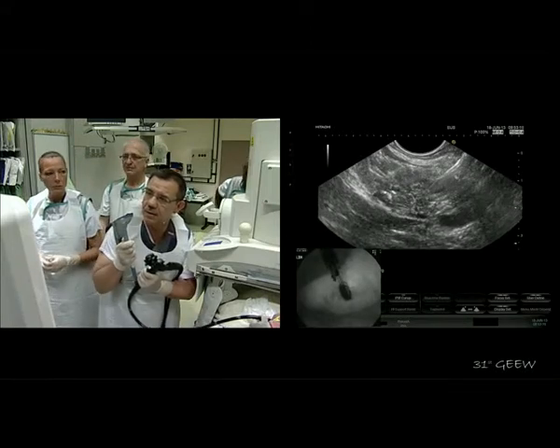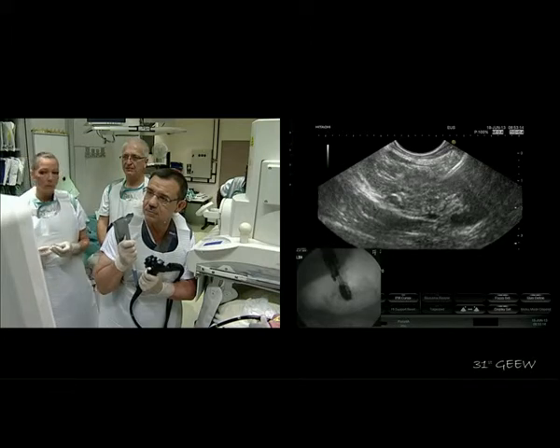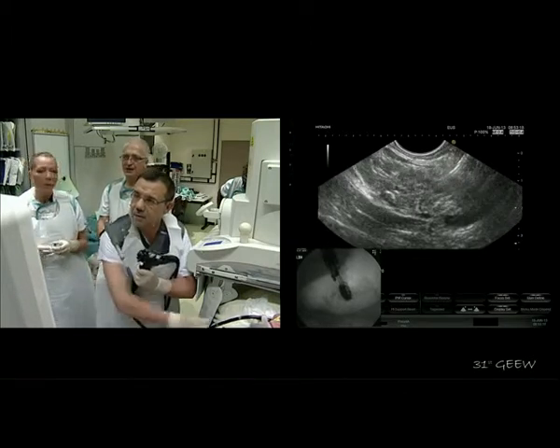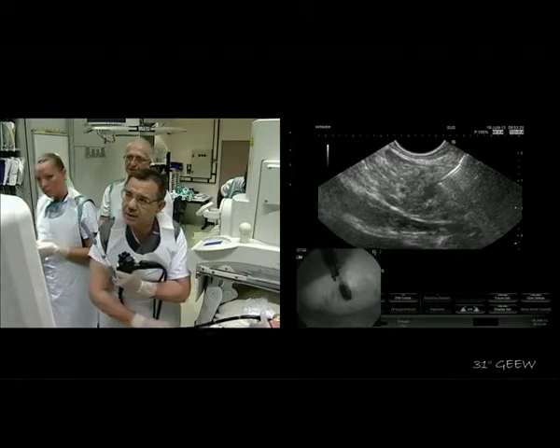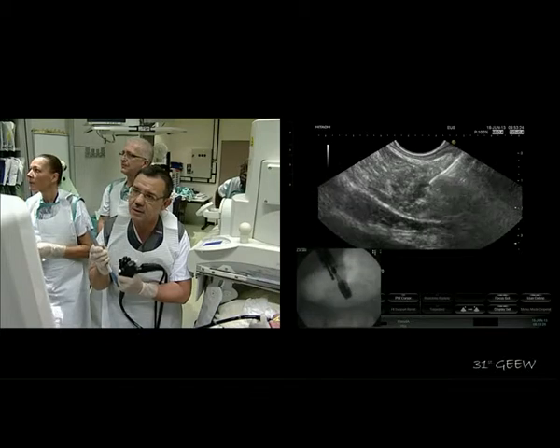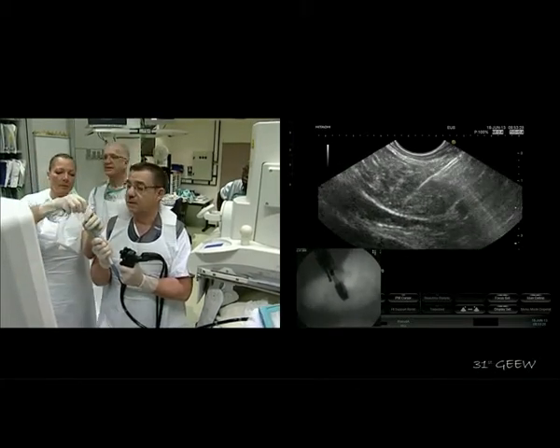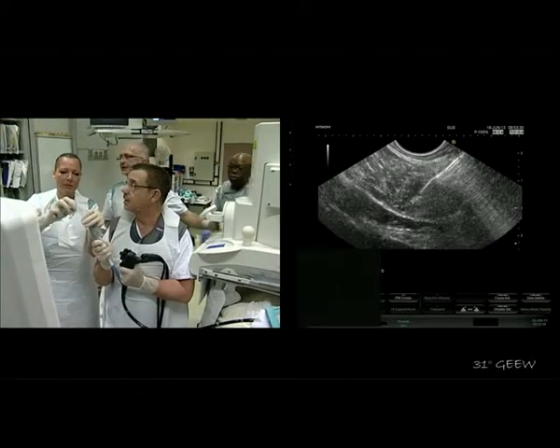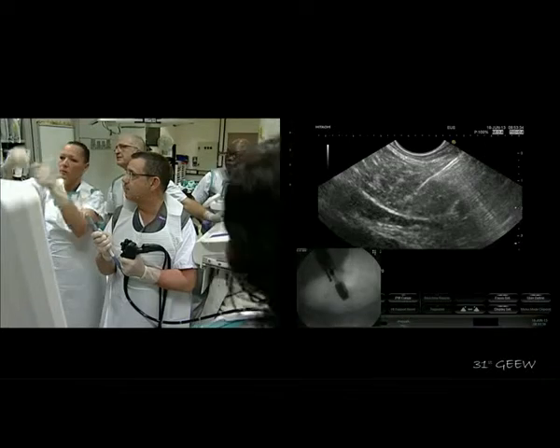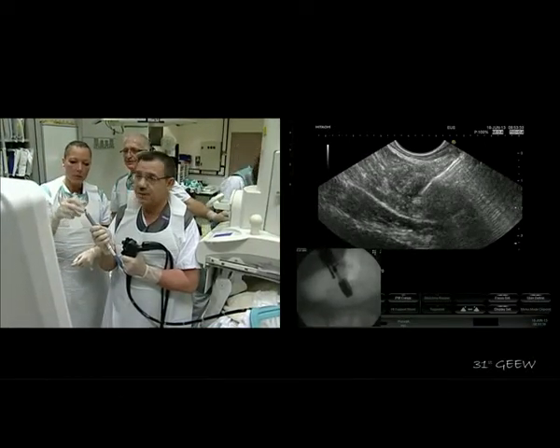Probably I'm in here, yes. You think you're in? Sure, I think. Yes, I'm in. So Sami, if you can. But I'm quite in the same position. Maybe not. No, you are more proximal. It's probably much better.